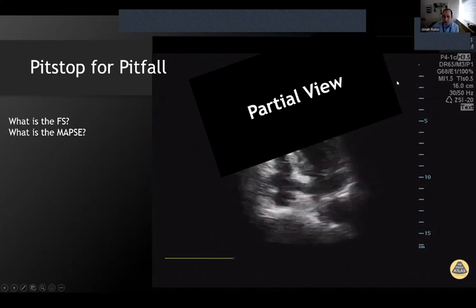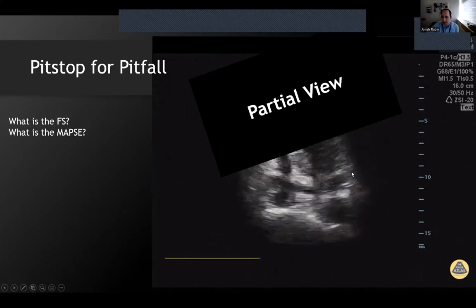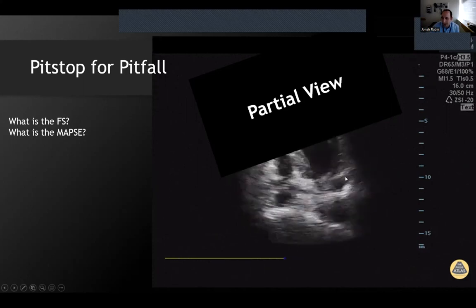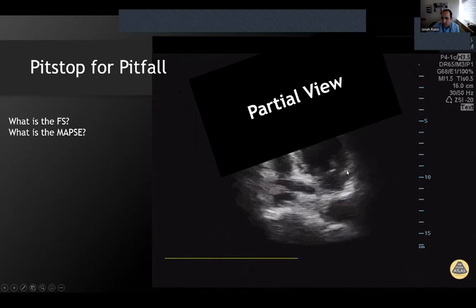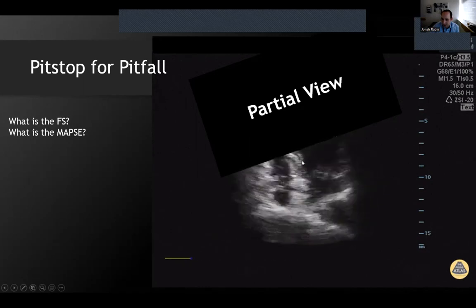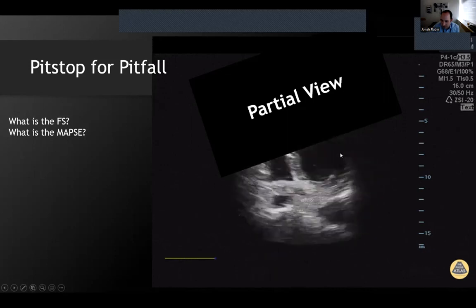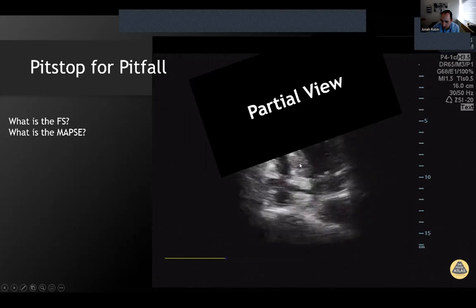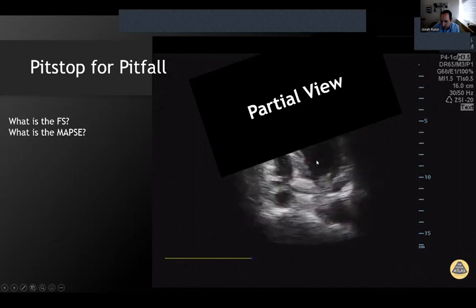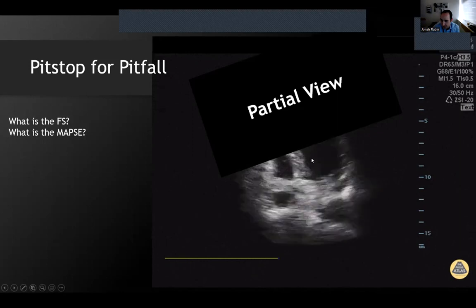Yeah, thank you so much, Omar, for being the brave soul for today. It's really hard. This is a terrible clip, and sometimes it's very representative of what we might get in the ICU. The annulus here, you can argue, is moving. It's hard to see, but it seems like there is some excursion here. And if you look at the walls, it's hard to know how much of this is shadowing artifact and how much is real, but it could look like the wall is thickening. If you were to ask me, I would say that this chamber is shortening over 25%, if you looked at end diastole and end systole.